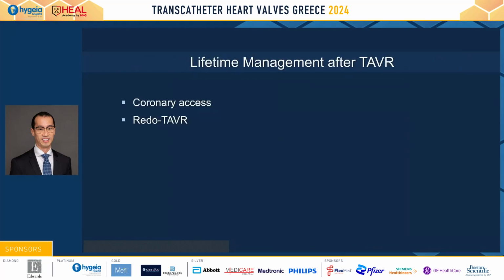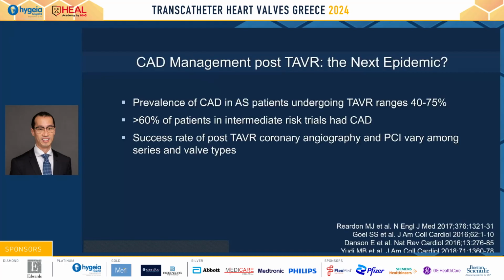Now, lifetime management after TAVR is increasingly important, and specifically coronary access and redo TAVR are now hot topics in most meetings. And the reason being CAD after TAVR is really prevalent. You can see that here, even in intermediate risk patients, over 60% of them have coronary artery disease.